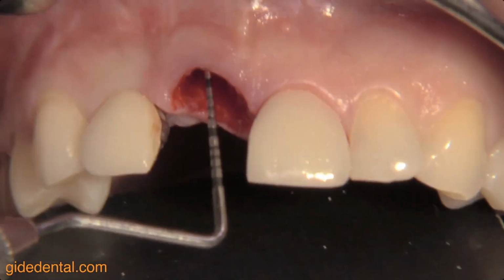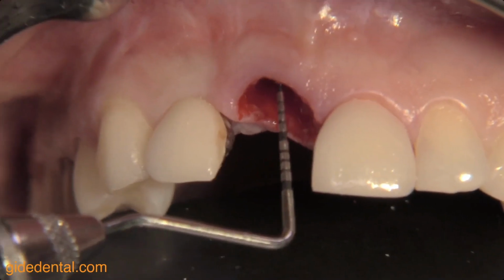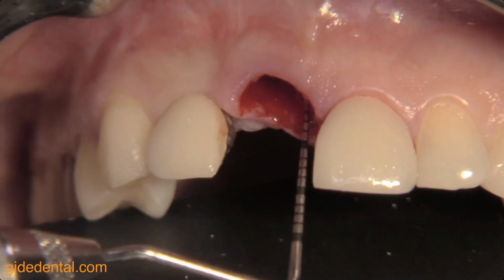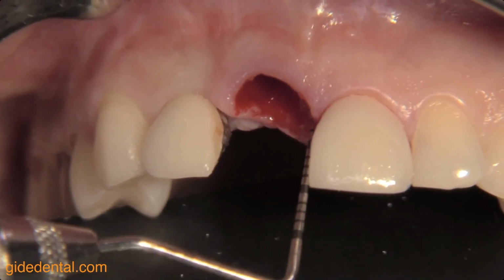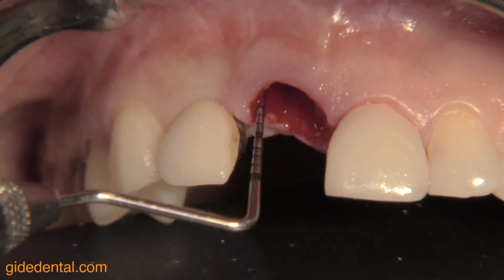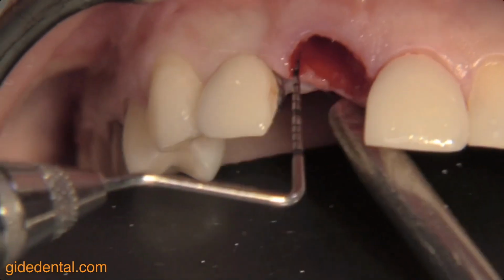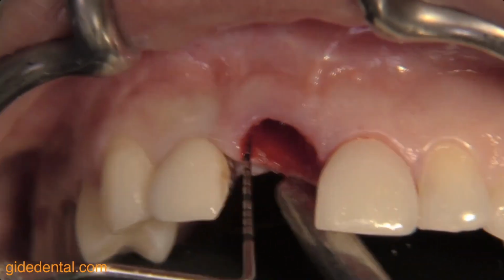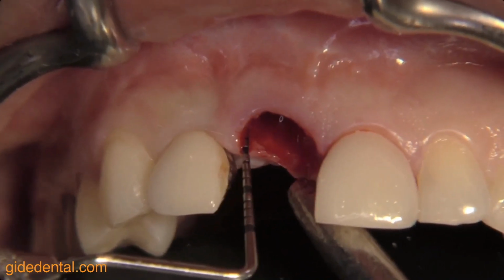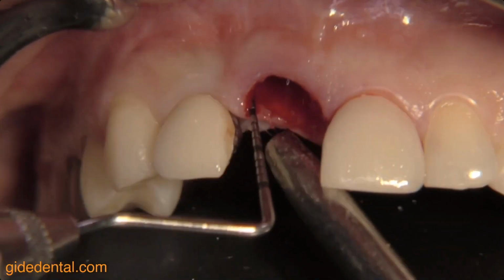And here's the check. The periodontal probe shows the distance. Okay, that looks good. So all the bone is present, so we have not lost any of the bone from the extraction site. That looks excellent. So we're going to follow this bone, as you can see here, with the periodontal probe.